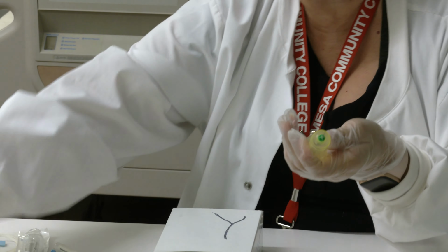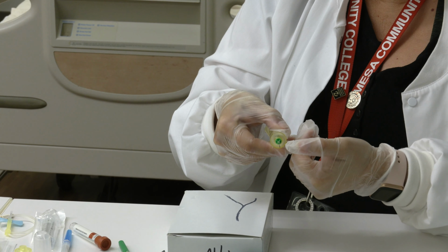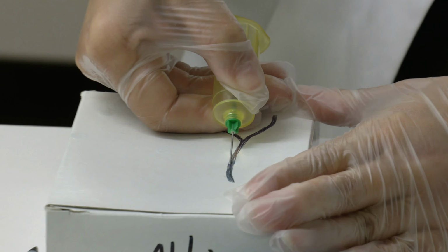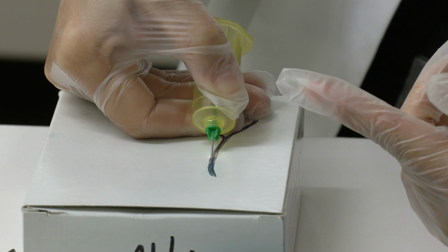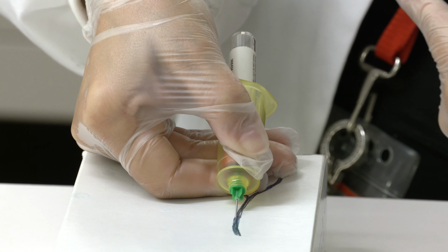So after I put my tourniquet on my patient and pop up my vein, then I'm going to verify that my bevel is up. And I'm going to enter straight into my patient's vein. There is going to be no way for you to know that you're in the vein until you put in your lab tube. And once you do that, it'll start popping back blood if you're in.